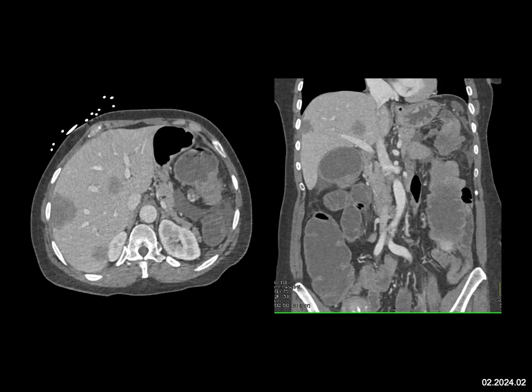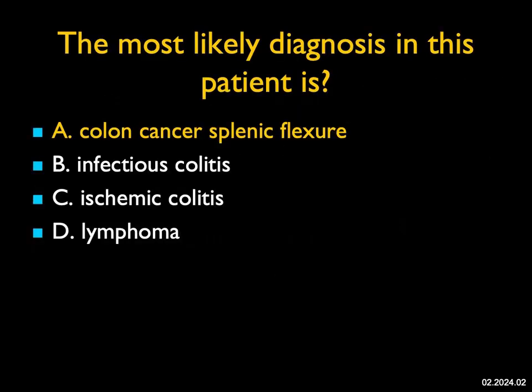This is not the appearance of infectious colitis, where there's diffuse thickening, not just a short segment — very marked thickening. It's not the appearance of ischemic colitis, though occasionally ischemic colitis can simulate cancer, particularly in the cecal region. And it's not bulky enough for lymphoma.